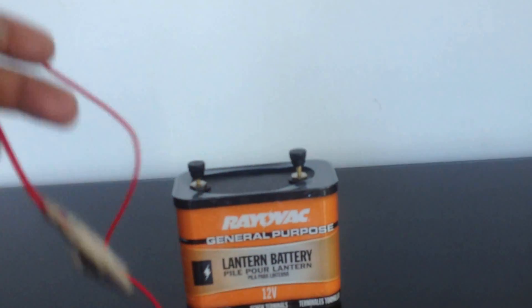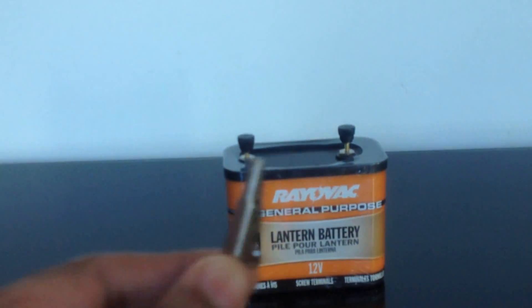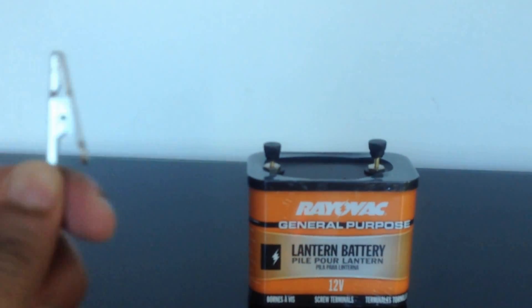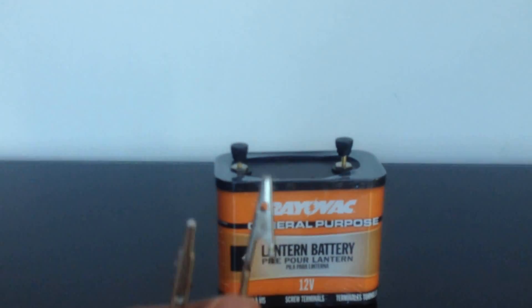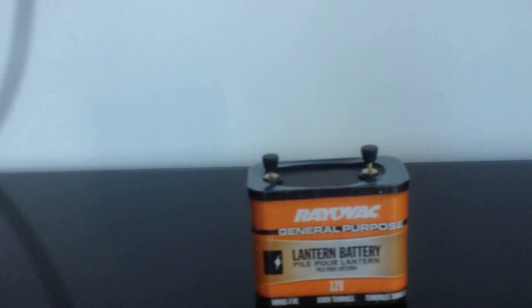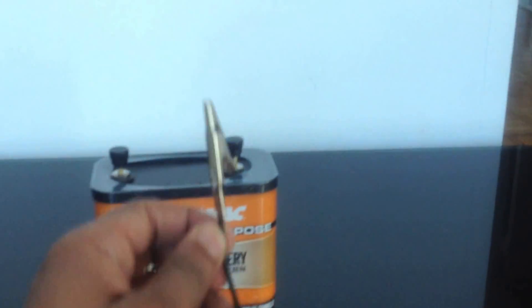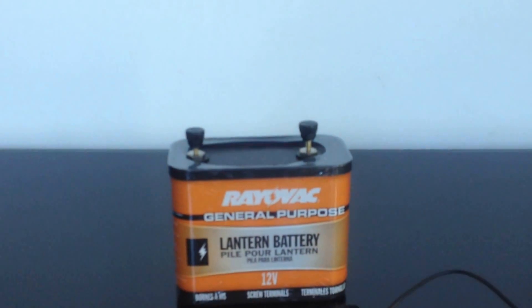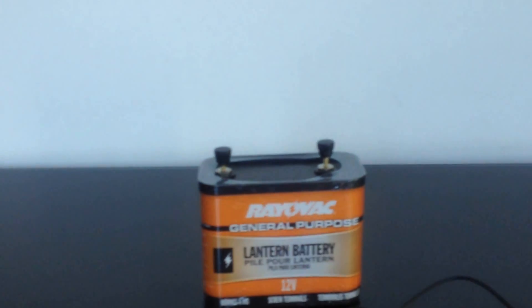You'll need two alligator clips. Alligator clips essentially look like this — they have an alligator end at each end, which makes them very easy to connect to or disconnect from the battery. I got two of them, one in red and one in black. Very easy to get from any home store, Amazon, or thousands of other stores on the internet.